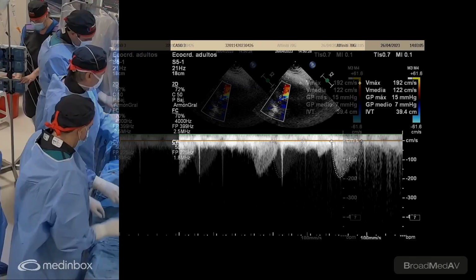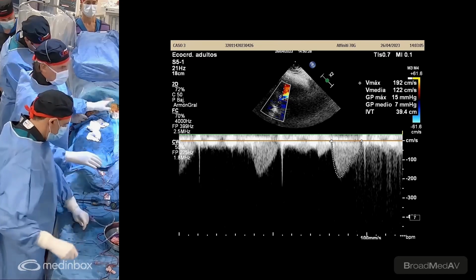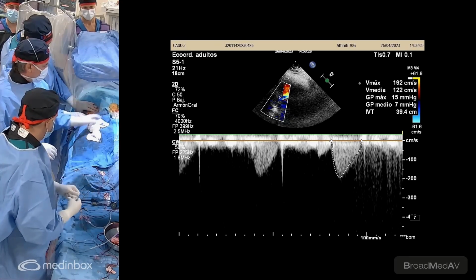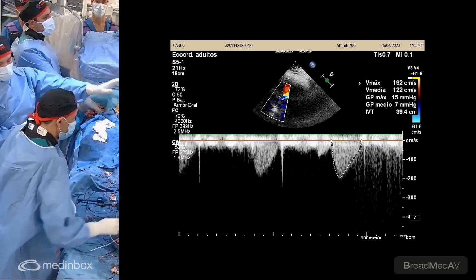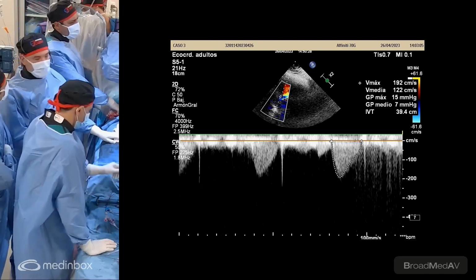So guys, our job is done here. Dr. Carlos Fava is going to fix the wire of the pacing for 12 hours or at least, and we will pull out or withdraw the contralateral sheath. While Franco, although we don't have a bleeding, we still compress probably for an additional 10 minutes. Good, excellent.